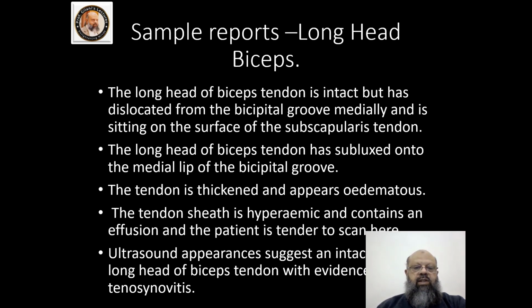The long head of biceps tendon has subluxed onto the medial lip of the bicipital groove. The tendon is thickened and appears edematous. The tendon sheath is hyperemic and contains an effusion and the patient is tender on scanning here. Ultrasound appearances suggest an intact subluxed long head of biceps tendon with evidence of tenosynovitis, which is the inflammation of the tendon and the synovial membrane.